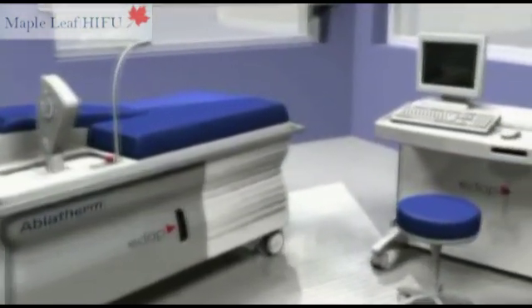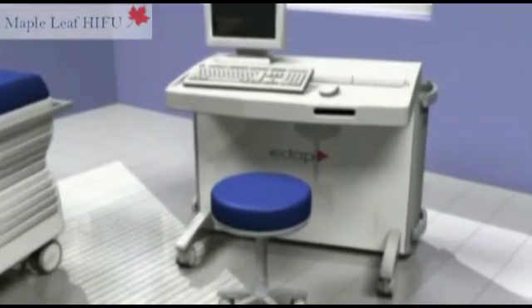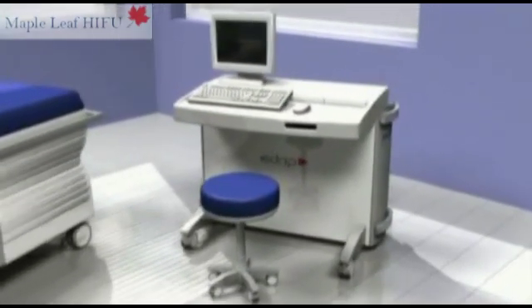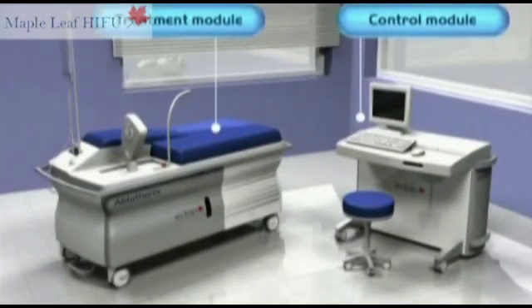The Ablotherm HIFU device is made up of two modules: the treatment module on which the patient is positioned, and the control module which enables the surgeon to plan and check the treatment via a computerized system.